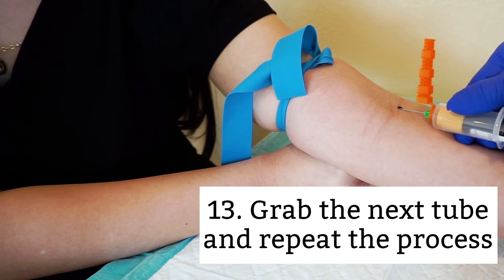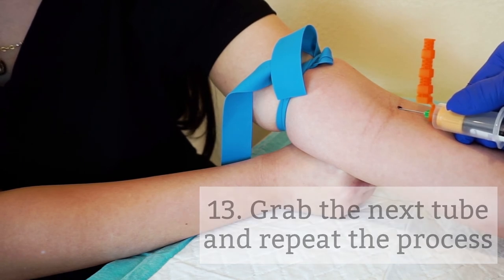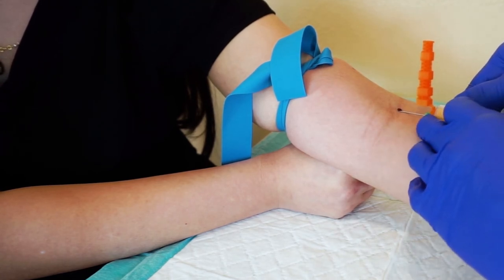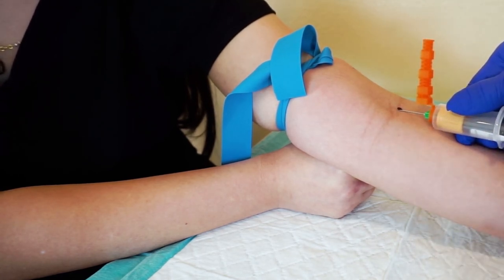Note, as you are more comfortable with the process, you can remove the filled tube, insert the next one, and while you're waiting for the new tube to fill, you can invert the previous tube.